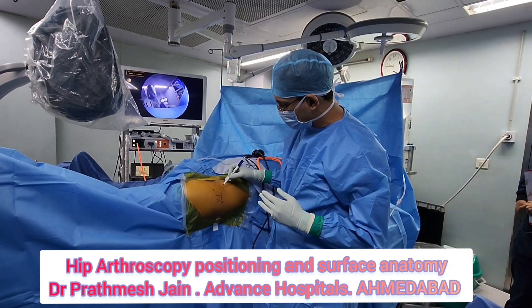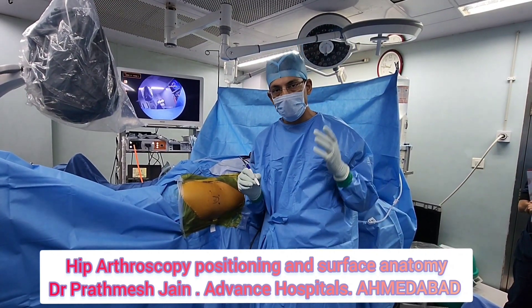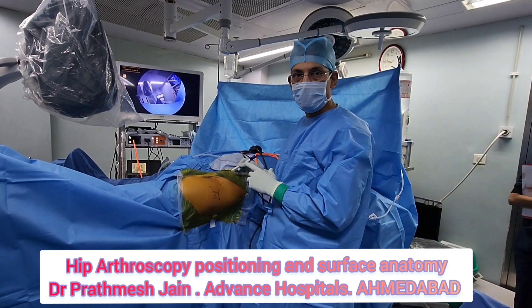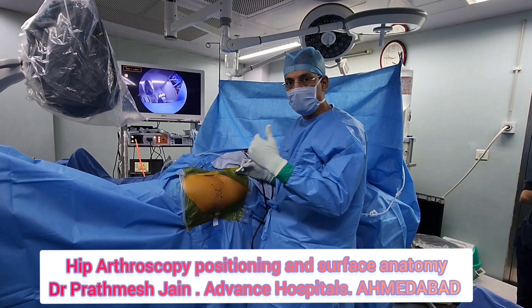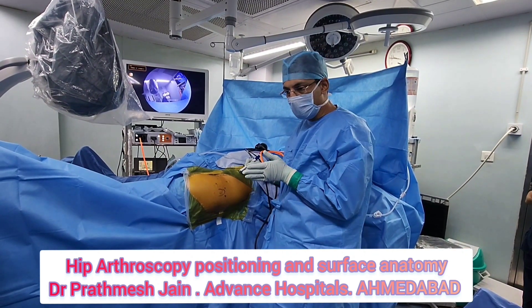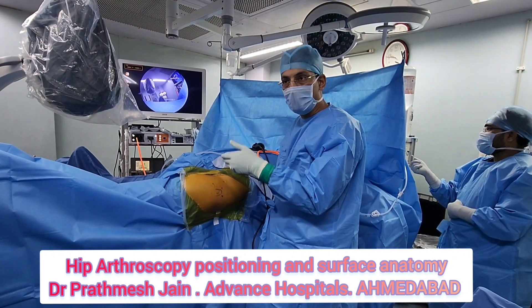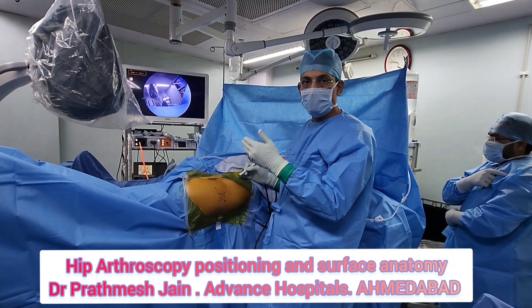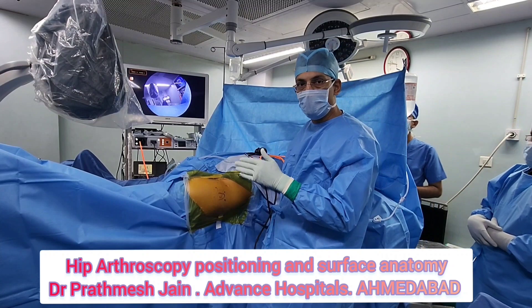Besides those three portals, you can place two additional portals here for evaluation and procedural work in the peripheral compartment. An important thing in the peripheral compartment is that you will be able to see the anterior part well, because the posterior capsule is attached more superiorly on the neck compared to the anterior part, where the capsule is attached more inferiorly.